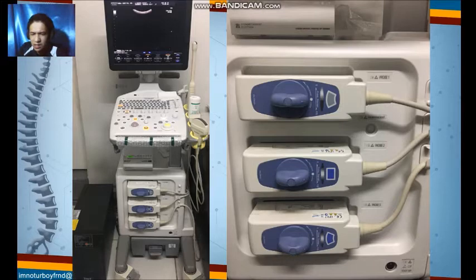Okay, so just a basic review of the machine, no? In case you forgot what it looks like. Some of you have been rotated in Sabal Hospital. So this is the setup for the ultrasound machine in Sabal Hospital.